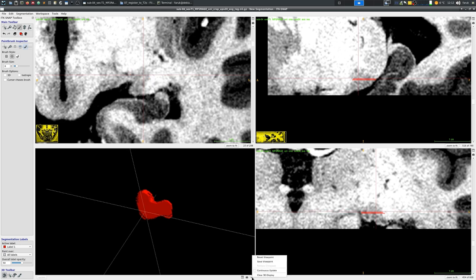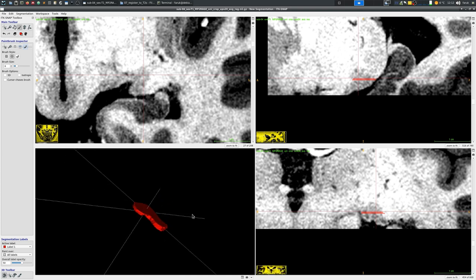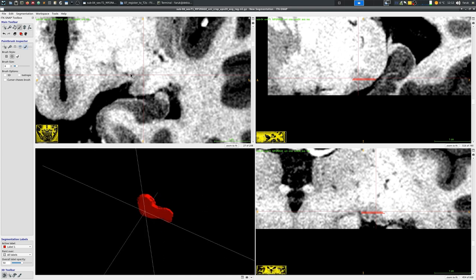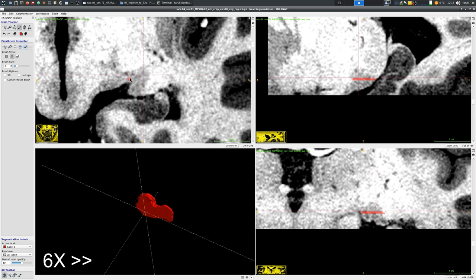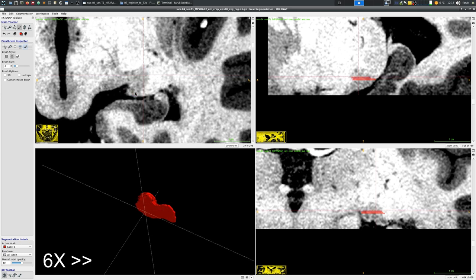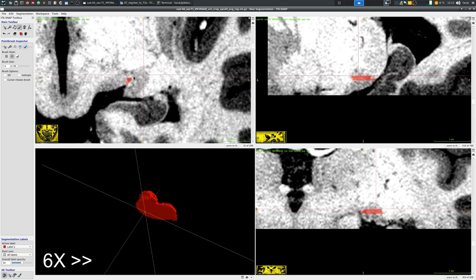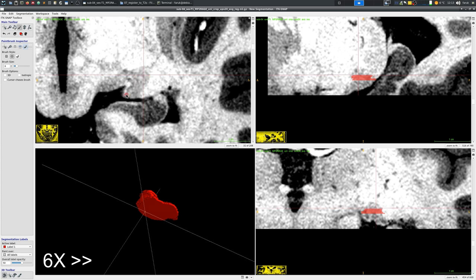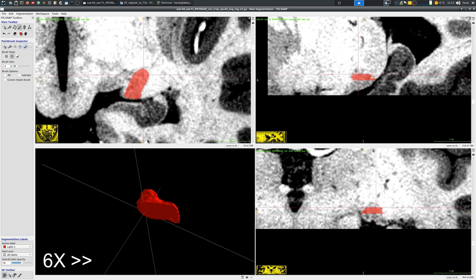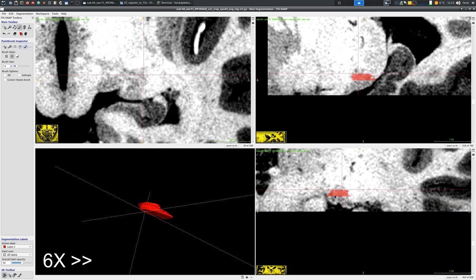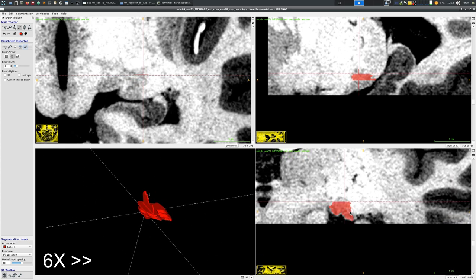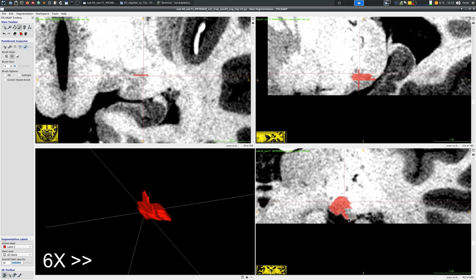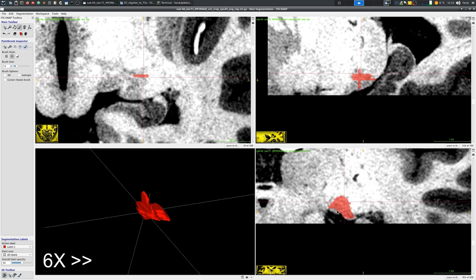One handy thing to do is to enable continuous update if you don't have a really large or really highly detailed segmentation. Basically you can in real-time segment voxels and see in 3D the area that you are covering. Here I'm just going to speed up a bit and go through roughly the LGN initial pass segmentation.